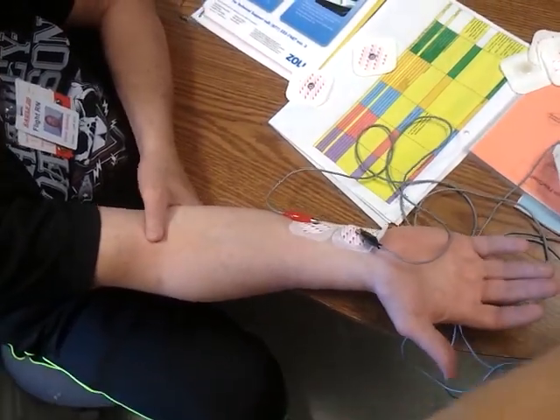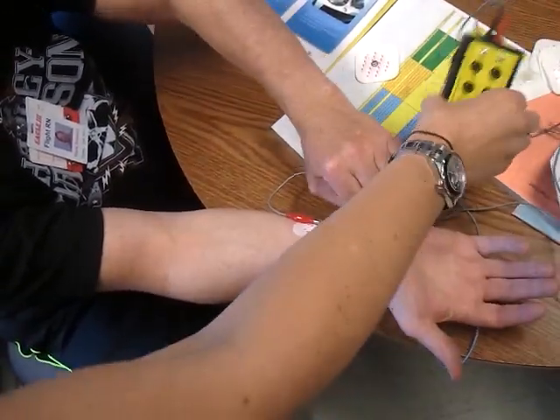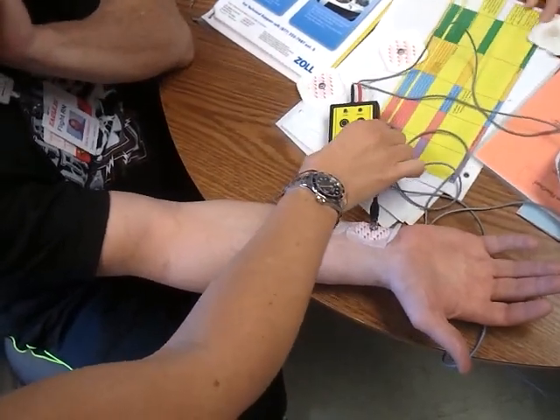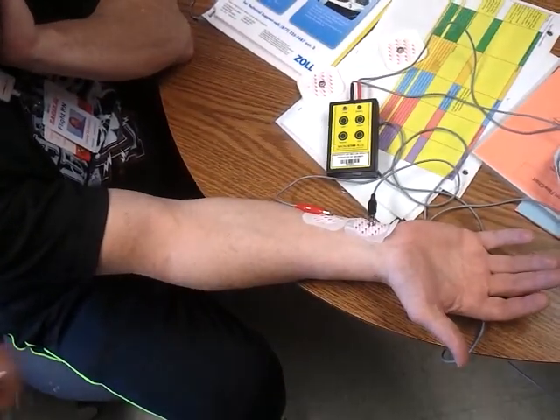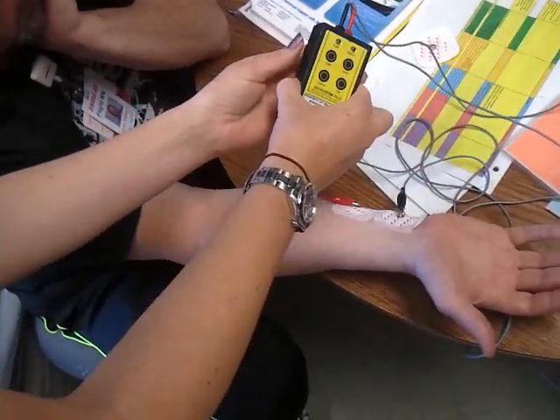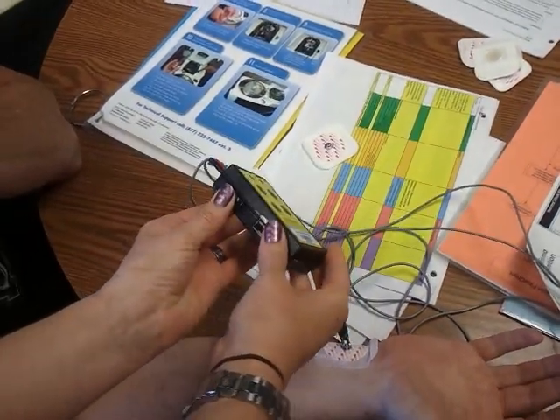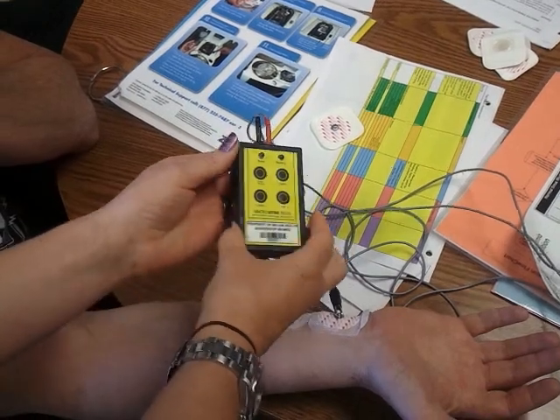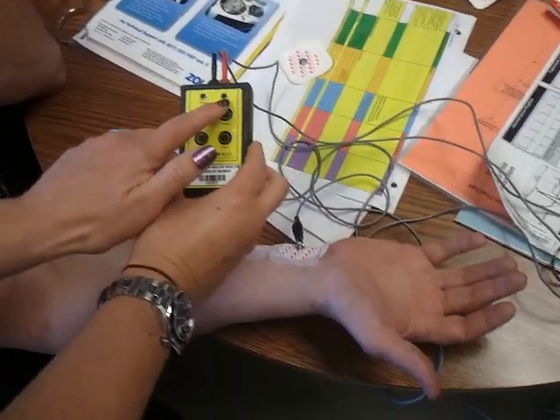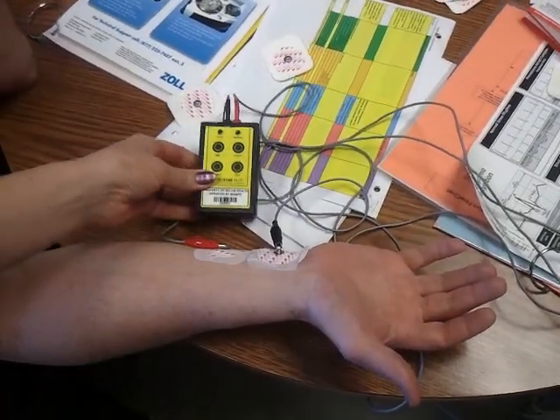Okay, and you always want to do a baseline. So before you start your paralytics, you're going to do this test and find out where they respond at what level. So right now it's on off and we're just going to turn it on to one. And you should see the green light that lights up that the battery is working.